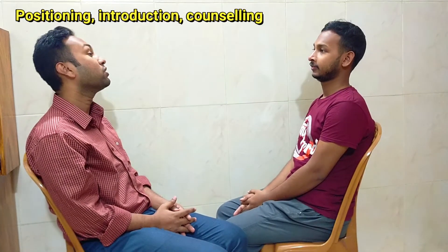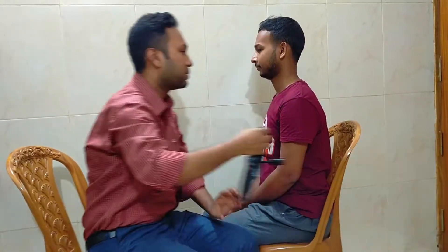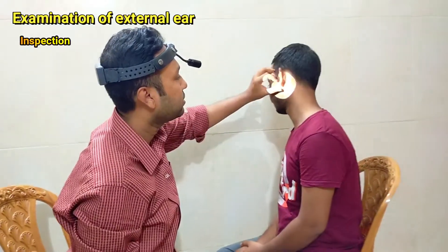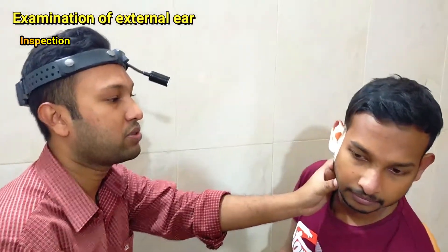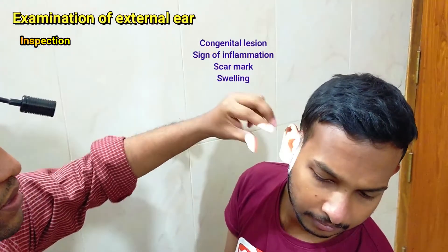After proper positioning and counseling of the patient, proper exposure is needed. Examination starts with inspection of the preauricular area, pinna, postauricular area, and subauricular area. Both sides should be inspected for any congenital anomalies, signs of inflammation, scar marks, and swelling.